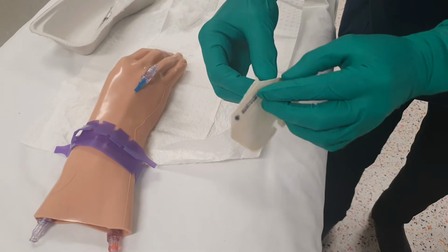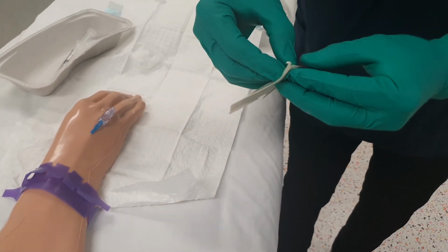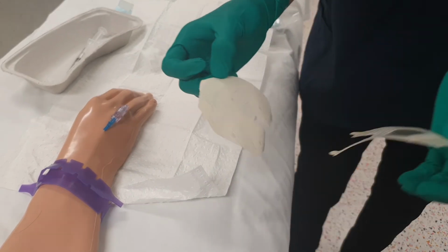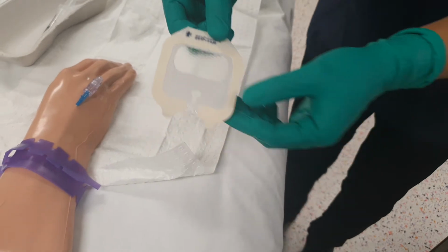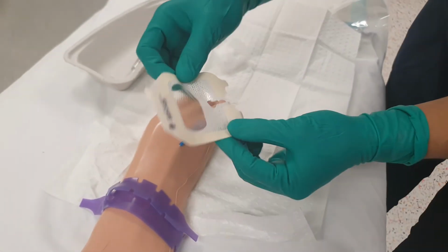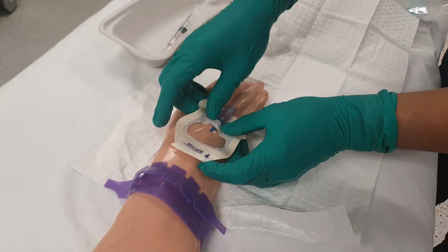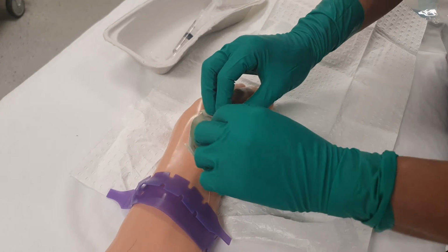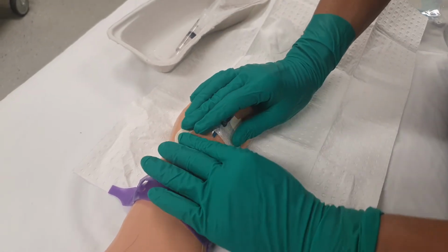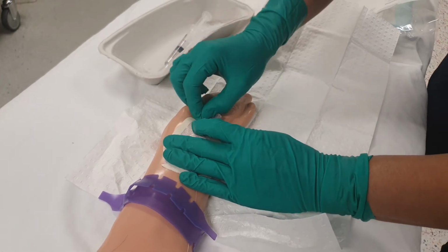Okay, so the next step is to remove this dressing here. The border's there to give you the rigidity and the flexibility, okay? See where there's this little area that bifurcates? It accommodates the junction of where the IV cannula cap meets with the IV cannula. All right, take off the border.